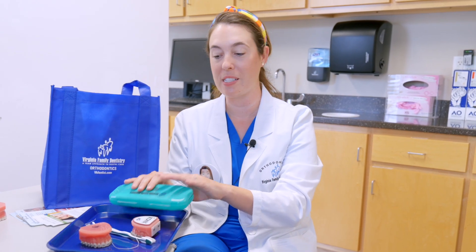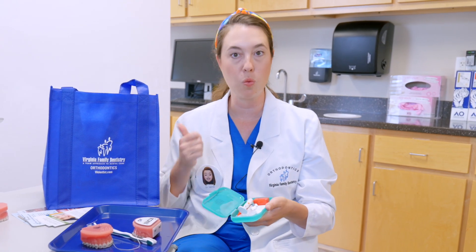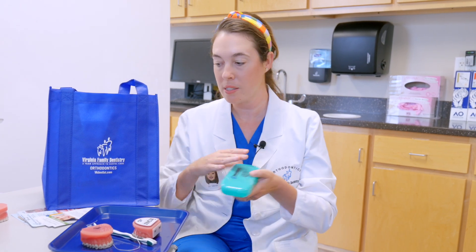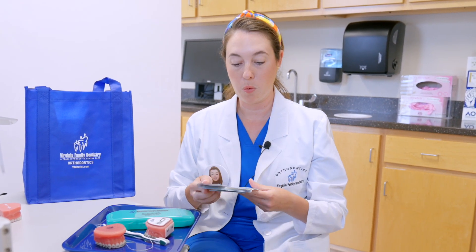Getting used to braces, we give you this little kit — it has all the little goodies that you need: wax, extra little tools called interproximal brushes, to just get all of that stuff out of the braces. You're going to go home with all sorts of goodies. We also give you everything in writing — we go over it with you in office and write it all down with lots of good pictures on how to take care of your braces.